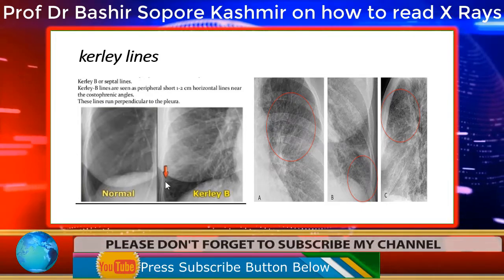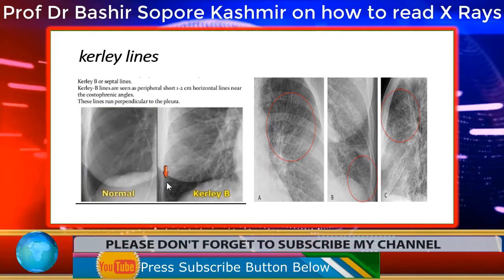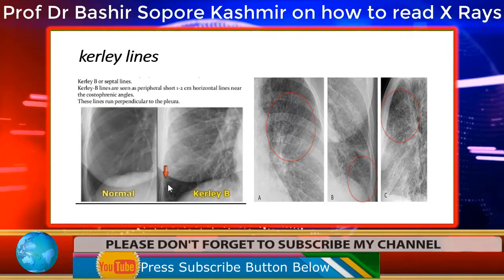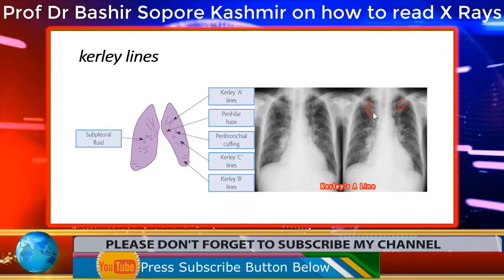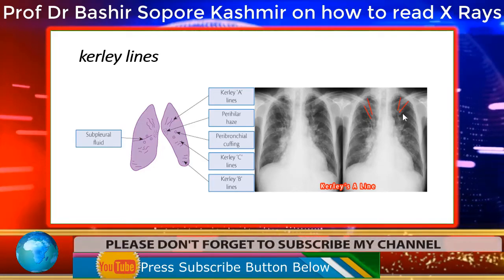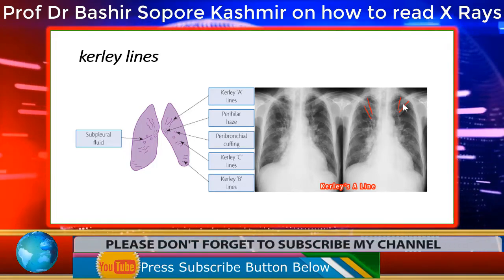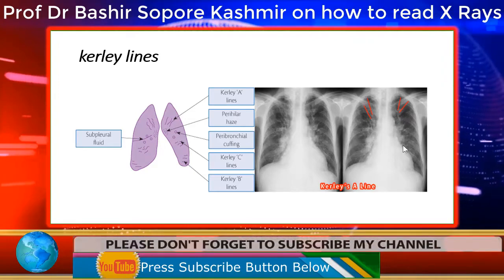These Kerley B lines will be short, up to 1 to 2 centimeters, mostly seen in the costophrenic angles. You can see here, as I said, these are oblique linear opacities, right, which we call Kerley A lines. So I think this is clear.